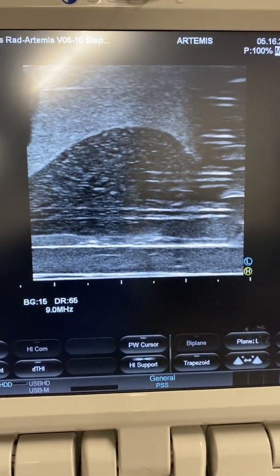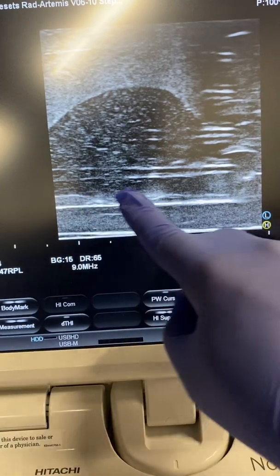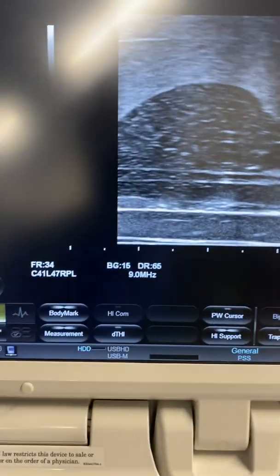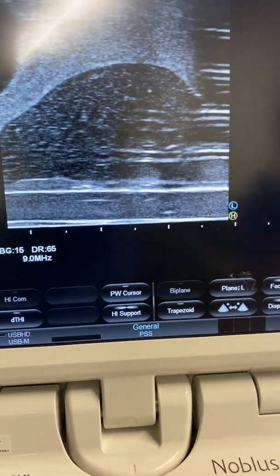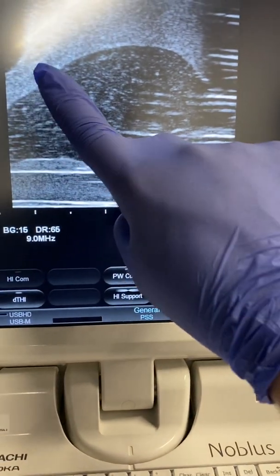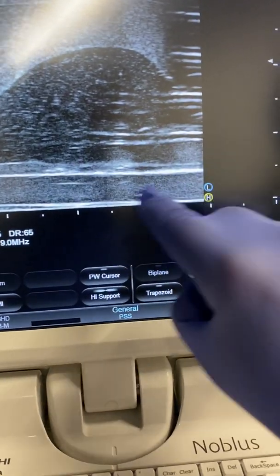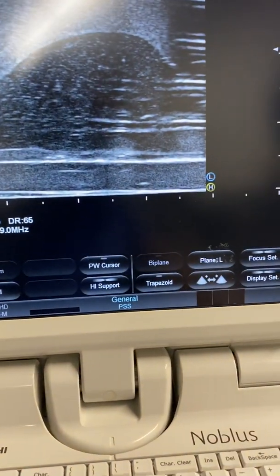They'll gauge how well the gel spread — did it go from base to apex? You should see the gel spreading along the whole part of the prostate, between the prostate and the rectum. They're typically more concerned with the apex end. If it seems like most of the gel went toward the base, that's actually okay, because the seminal vesicles naturally push the base away from the rectum. The SpaceOAR rep will say it's good to get more coverage at the mid and apex end, since that's the end that typically gets radiated accidentally.